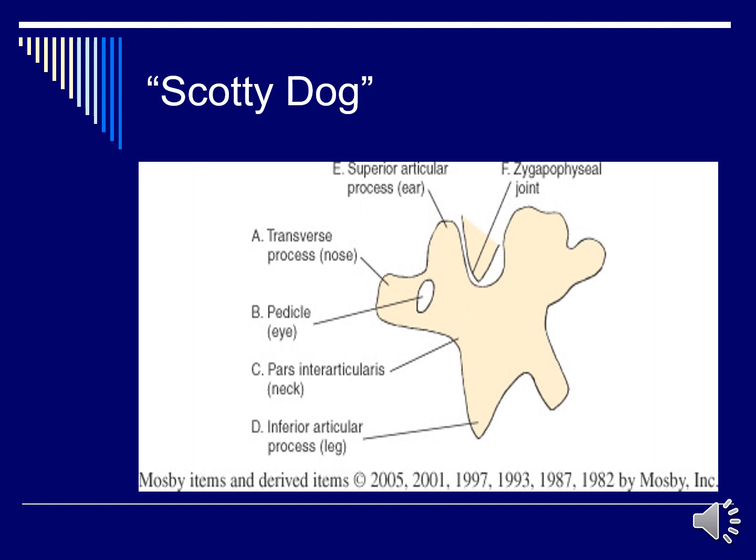Now, the Scotty dog was a way to help new people who were looking at radiographs identify the structures that are supposed to be best demonstrated on the oblique lumbar spine. So it is said that you can see what resembles a real-life Scotty dog within the structures of the lumbar spine. Looking at this, E would be the superior articular process on the vertebra, which makes up the ear of the dog. A is the transverse process, which makes up the nose of the dog.